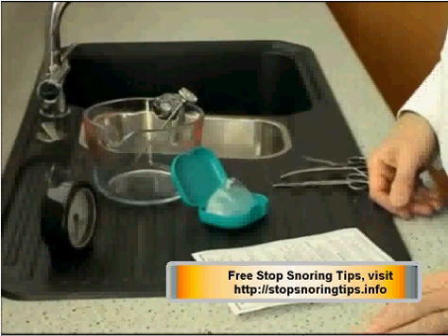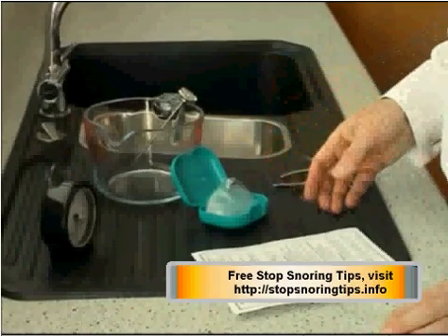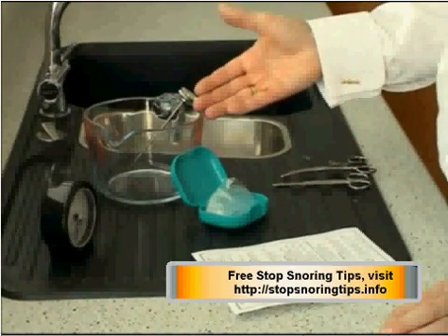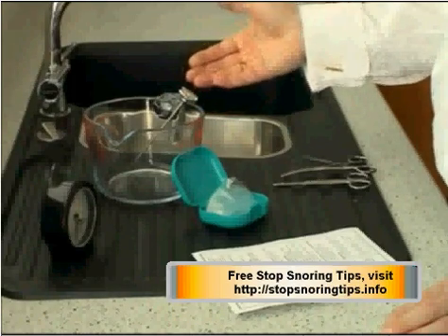I'd like to show you how quickly and easily you can mould a Somni Snore guard. You'll need the Somni Snore guard, a jug or a bowl to put your water in, possibly a thermometer if you've got one that will read 65°C, but it's not necessary.